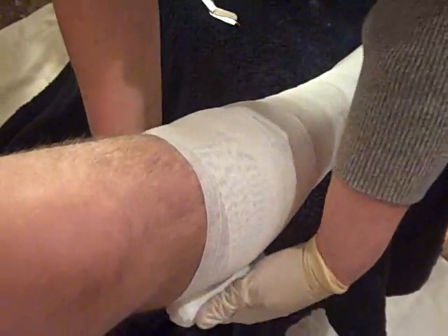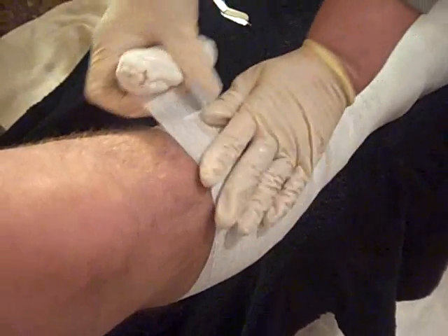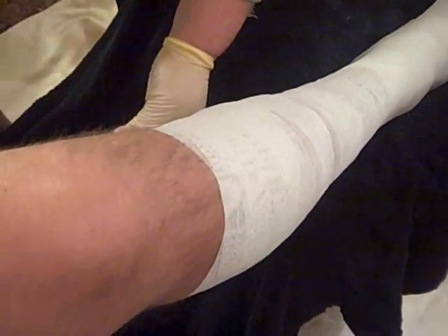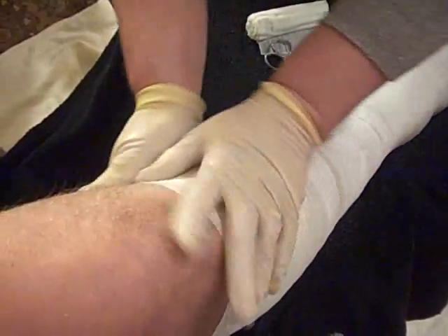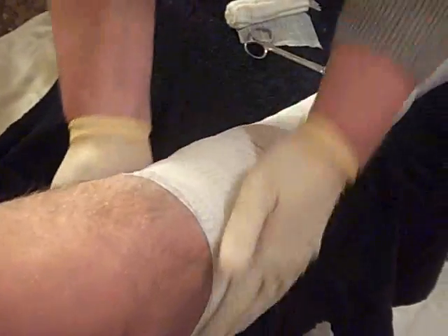How far do you go up? You always want to wrap to about one inch below the knee. Any excess that you have, you can go ahead and cut off and secure it because it will actually stick to itself. This one is a zinc oxide base. Okay, so we're wrinkle-free.